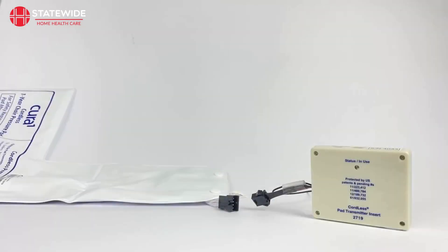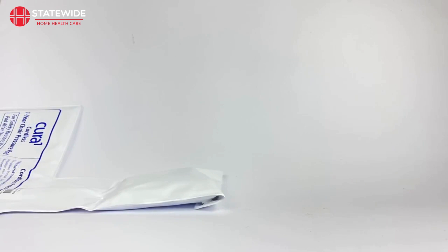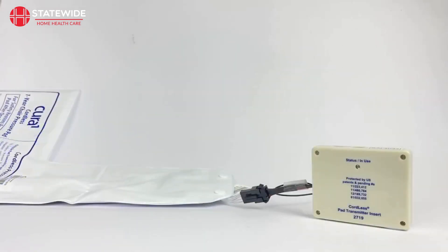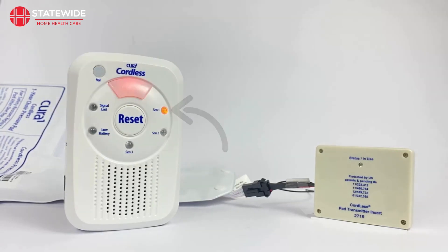The process for pairing pads and mats is slightly different. Most of our pads and mats require a transmitter to send the alarm signal to your monitor. The transmitter connects via a clip attached to the pad or mat and rests in a pouch away from view and exposure. To begin pairing, ensure the transmitter is clipped in and initially switched off. Then put your monitor into programming mode. From here, all you need to do to connect the transmitter to your monitor is flick the transmitter switch from off to on. Your monitor will beep and the corresponding sensor LED will illuminate to indicate successful pairing. The monitor will automatically exit programming mode once paired.